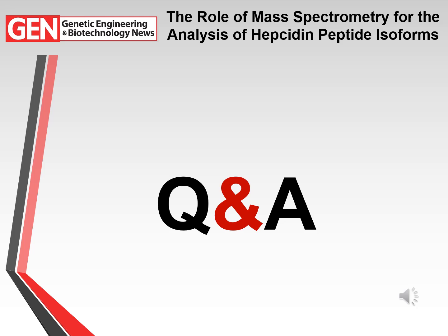As we've moved on, many groups have moved towards using LCMS for the analysis.